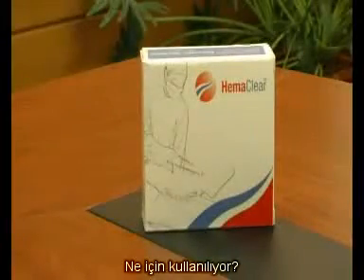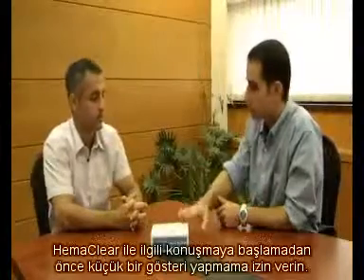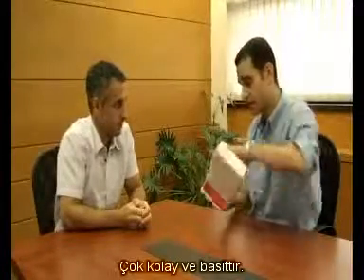What is it used for? The Hemaclear enables you bloodless orthopedic surgery. Before I start talking about the Hemaclear, let me give you a small demonstration. Okay? It's very easy and very simple.